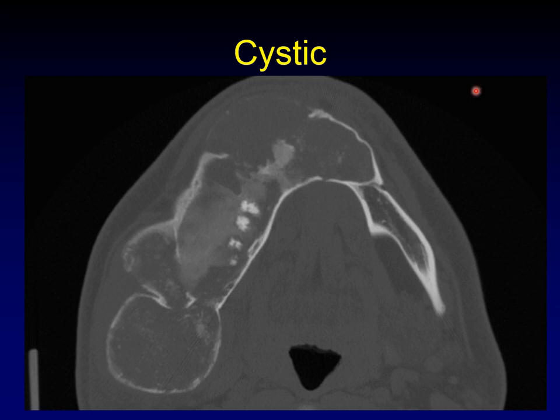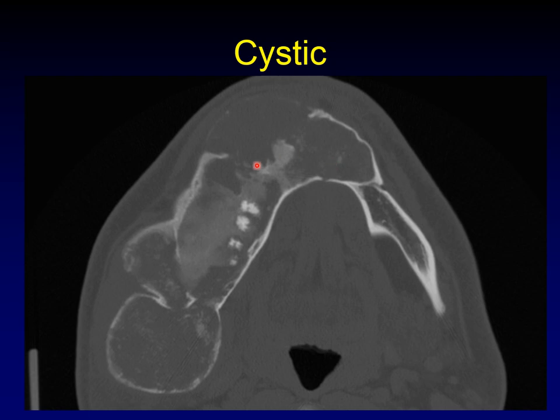This is the cystic form of fibrous dysplasia. There's some ground glass here for sure, but this jaw is expanded and there is relatively little calcification in the center of these large cystic areas. Notice that the cortex is relatively intact around the expanded bone and that the overall shape of the mandible is preserved.